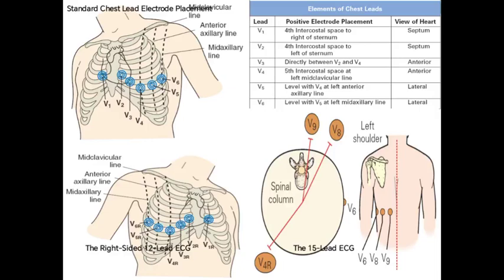Also we have what is called the right precordial leads. We use the same positions, but we put them on the right.